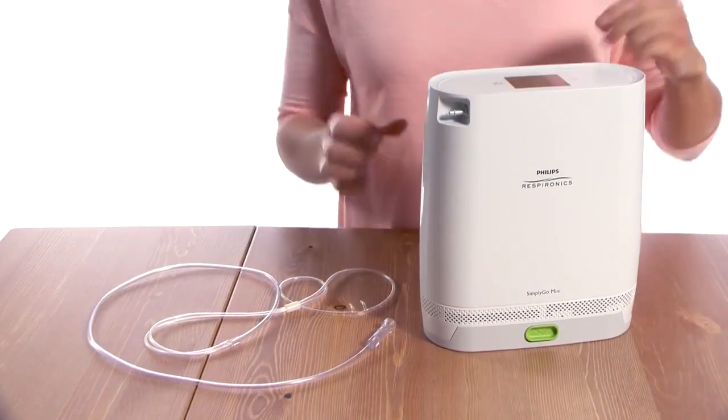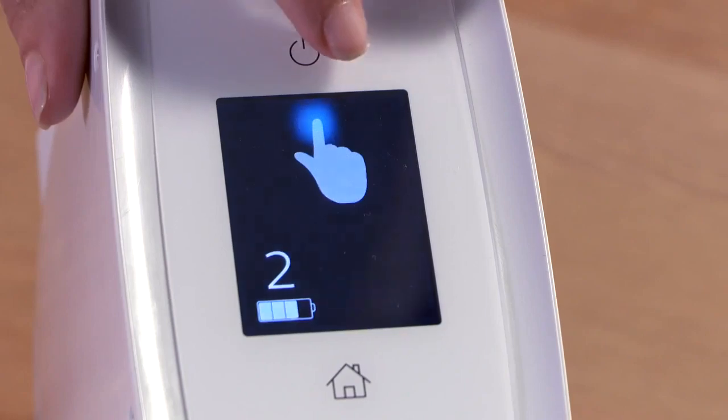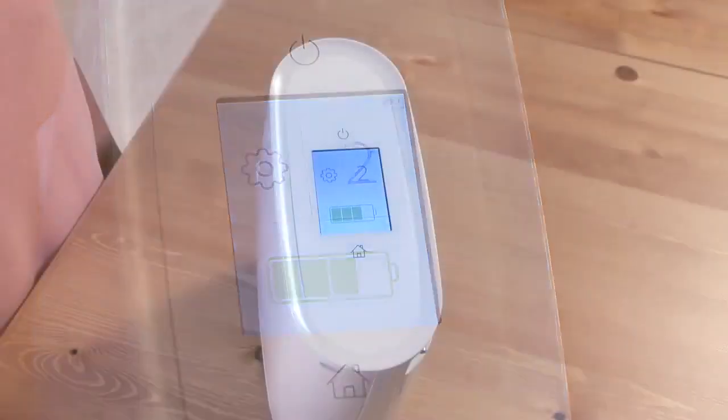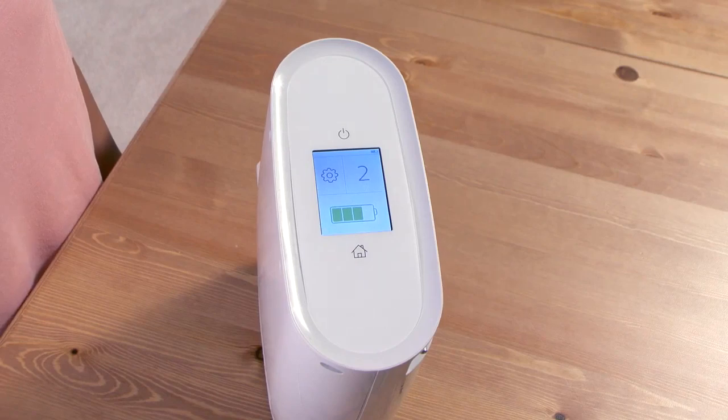Turn SimplyGo Mini on by pressing the power button twice within 5 seconds. This prevents unwanted starts and inadvertent changes in oxygen flow.